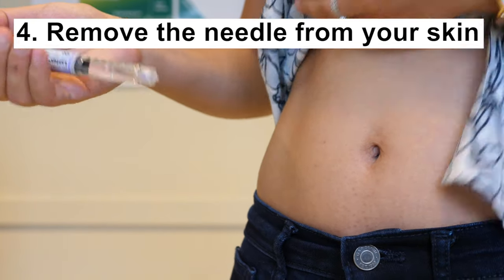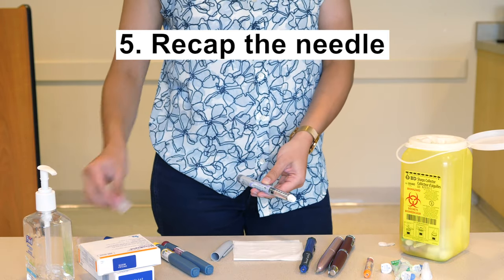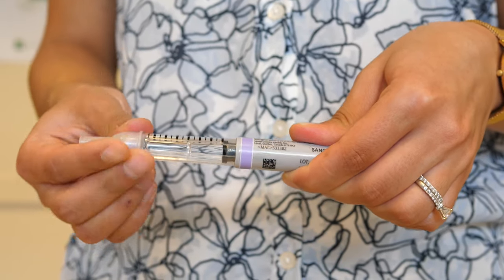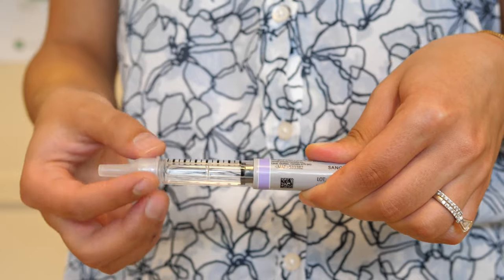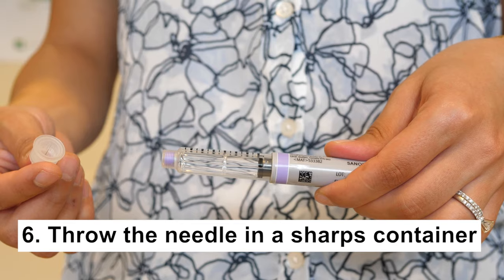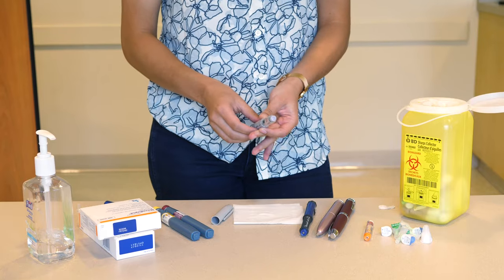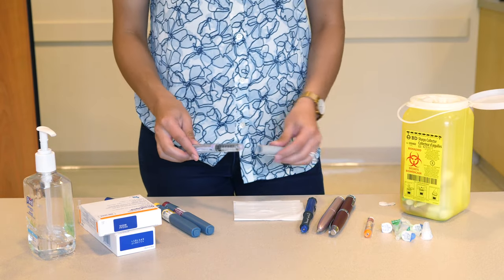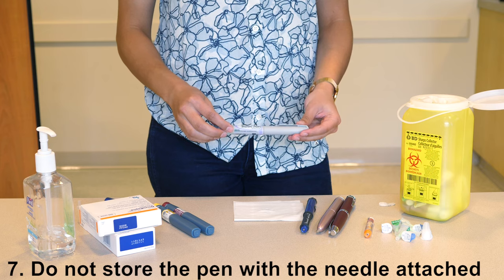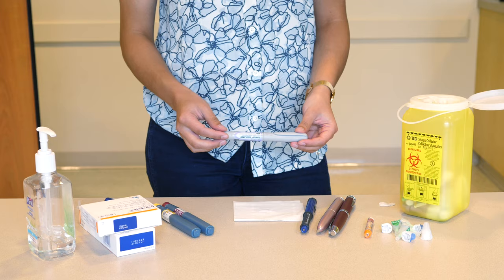Remove the needle from your skin. Recap the needle using the larger outer cap, then turn it to the left to remove the needle. Throw the needle in a sharps container or glass container with a lid. Never put the needle into your regular garbage. Do not store the pen with the needle attached, as air can be pulled into the pen if the room temperature changes.